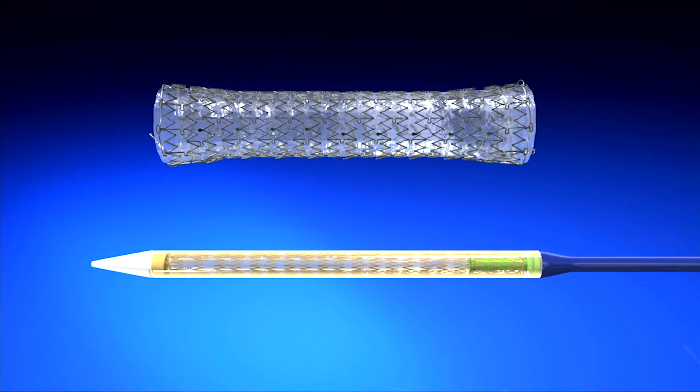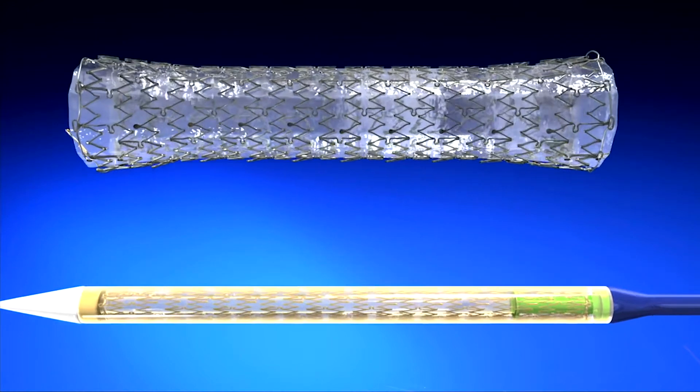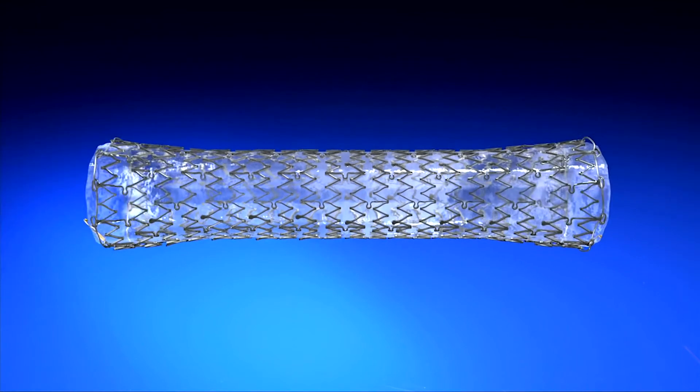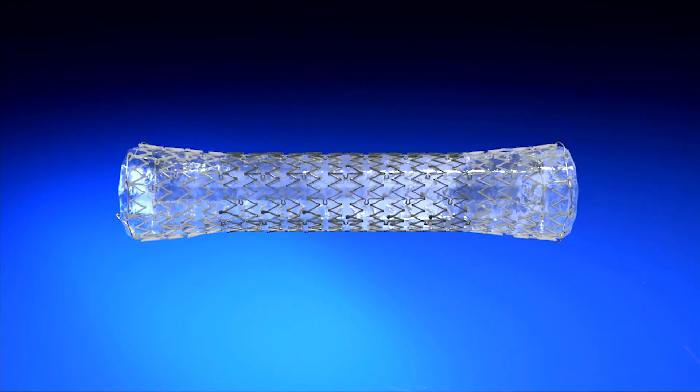The unique laser-cut design results in virtually no foreshortening or elongation commonly found with woven stents. The laser-cut design of the stent also allows for variation in radial force along the stent body with soft, flared ends and a firm mid-body.